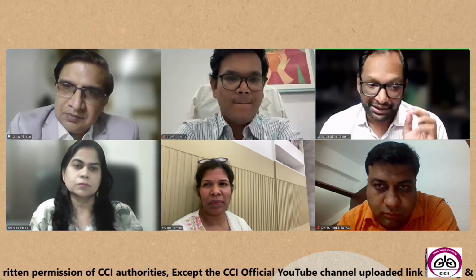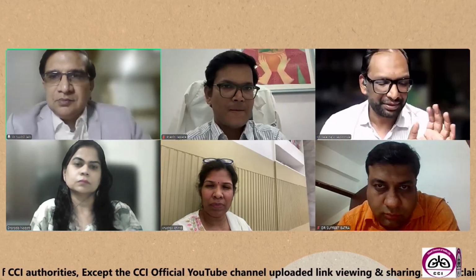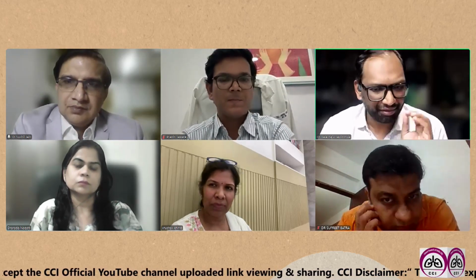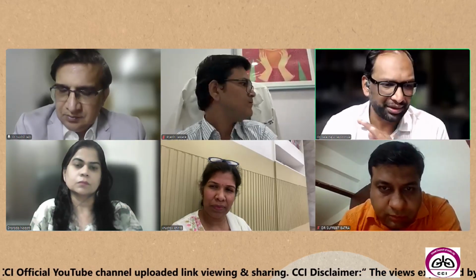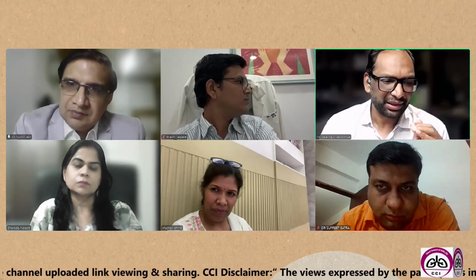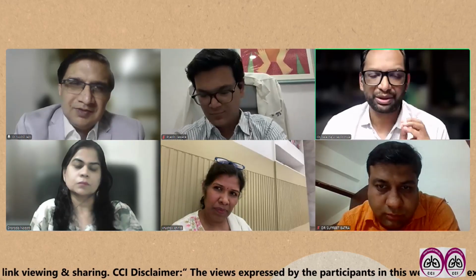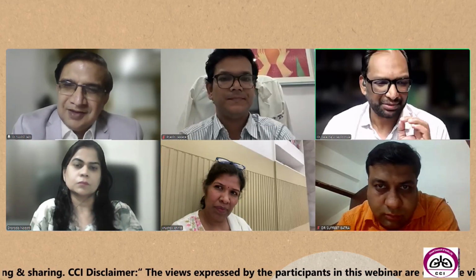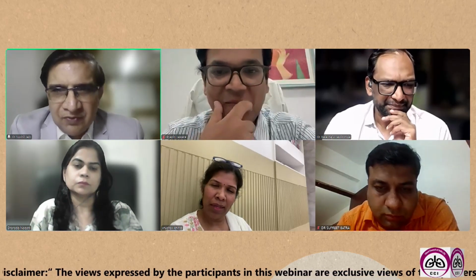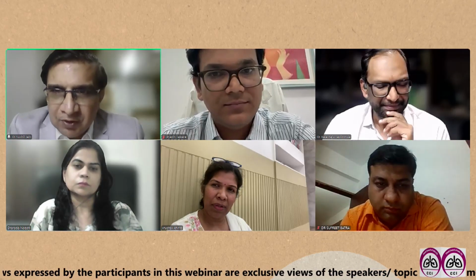Point two was specifically to your question, lymphomas. I have told you that I've given up 19 gauge needles. Now I only do a cryo intranodal biopsy that has given far superior yields compared to any of the needles available. This is what I feel currently. I'm only using intranodal cryobiopsy, with better results. We have now moved on to cryobiopsy, especially in lymphomas or benign lesions sometimes, and in those which are negative on EBUS.